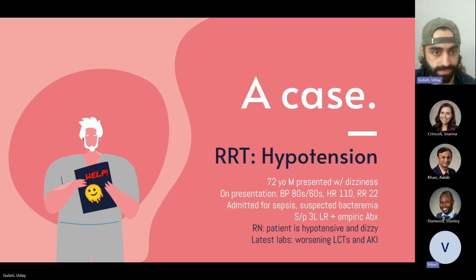Anyone here? Sanjay, you set it up, so I know you're in the room. Yeah, I'm sorry. You showed that the guy was hypotensive, and I'm sorry, I missed the second part. He's feeling dizzy. You're concerned he's lightheaded. You're concerned about the blood pressure. How are you initially assessing the patient?